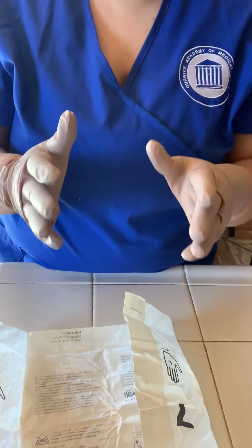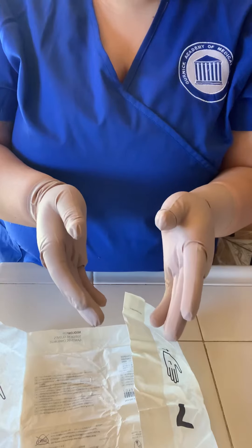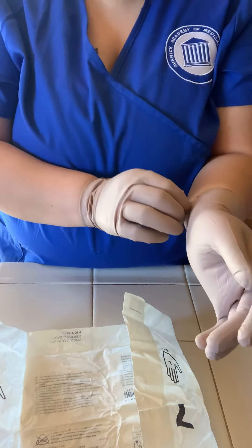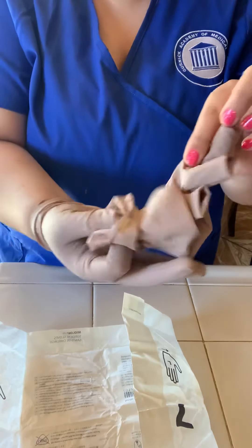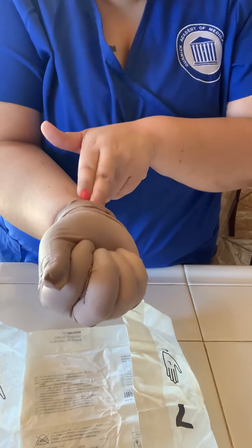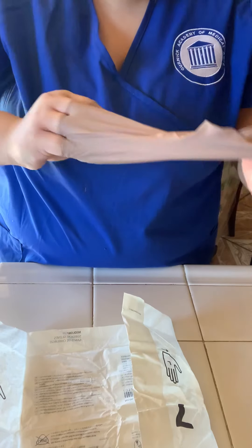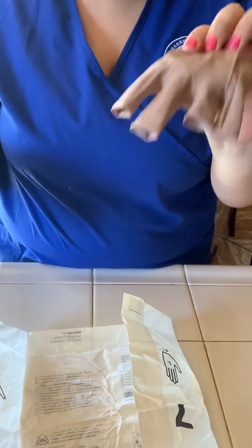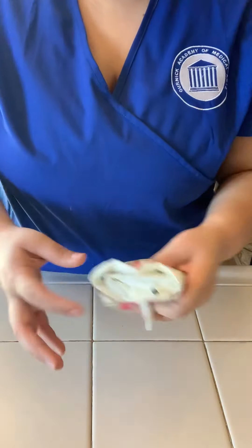That is going to be the procedure on how to glove. Now to un-glove, you're going to go ahead and pull like this for the first one. Make sure that when you're taking it off, you do not touch your wrist. You're going to fold it up just like this, and then with this hand go underneath — you don't want to touch the outside of it. Now this is trash. You can go ahead and discard all your trash, and once you have discarded everything, you perform hand washing once again, and you're done.